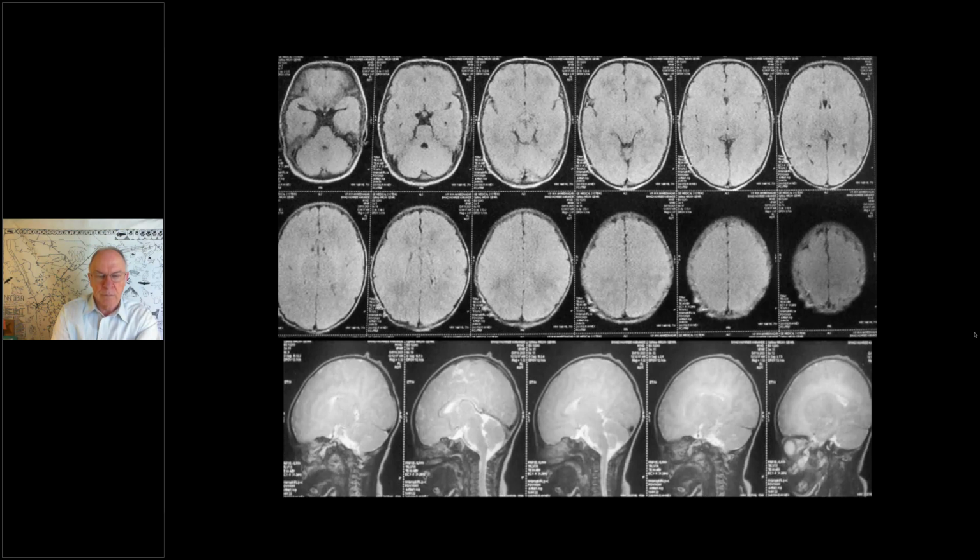So this old MRI was supposed to be normal. It was not showing anything much, though I felt there was a little crowding of the lateral ventricles. Sorry, I think I lost you. Yeah, you can go ahead with the current MRI. This is really of good quality.